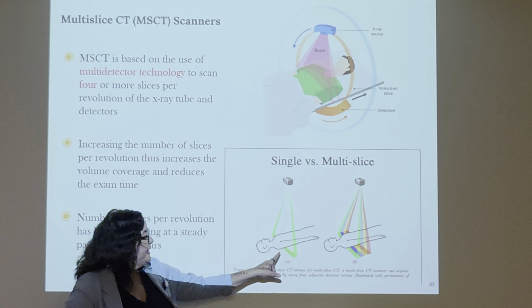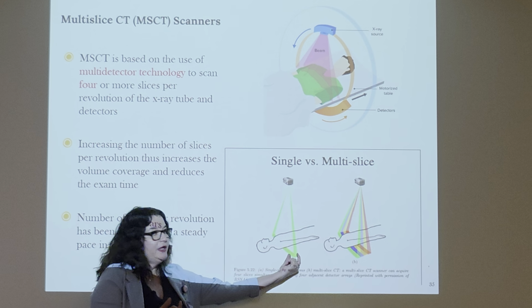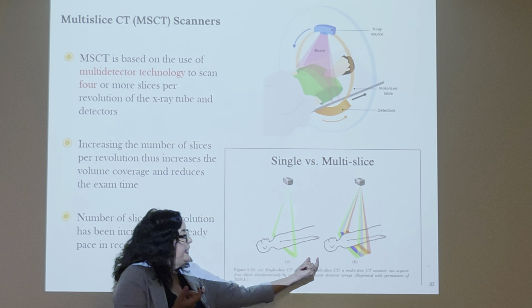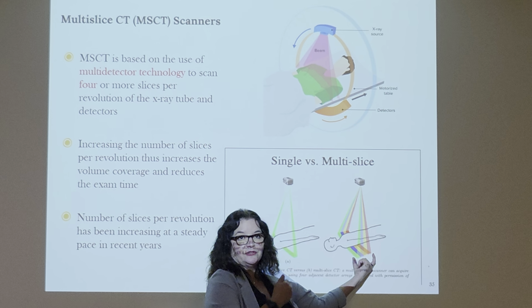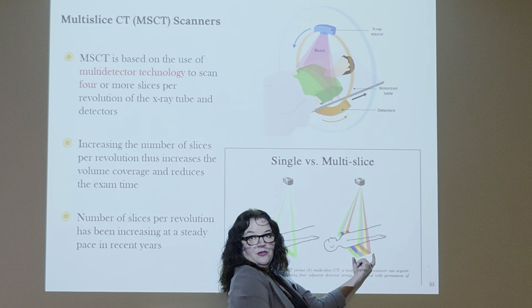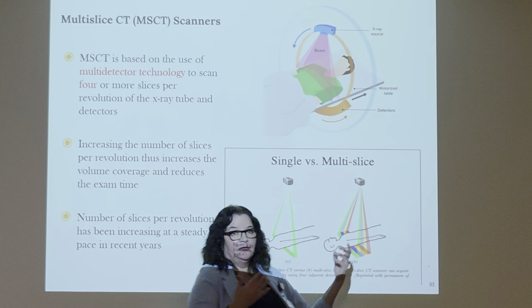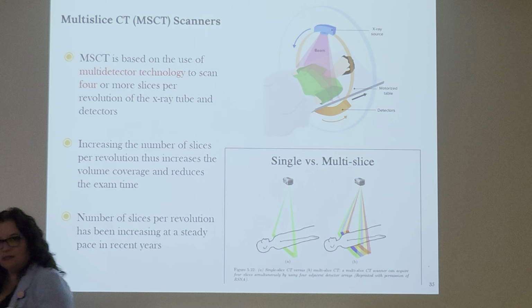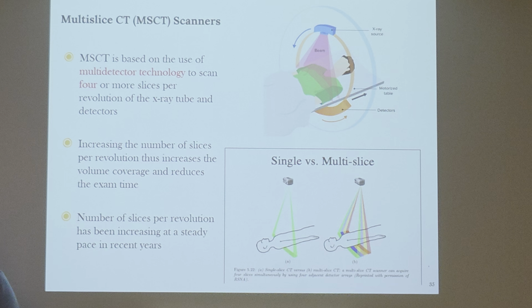So every pass, this was the limit, the width of that image receptor or detector. But now if you start placing detectors lengthwise along the plane, you now have a multi-slice detector, because you're getting multiple slices in one spin.